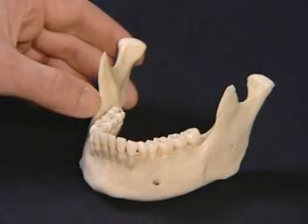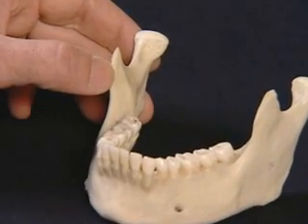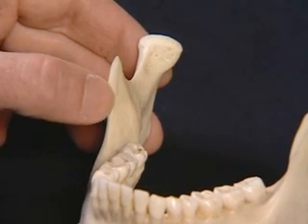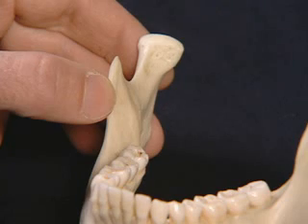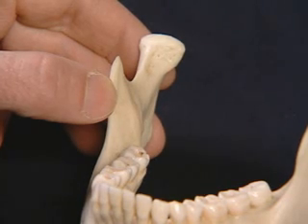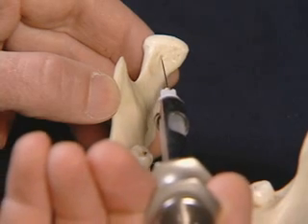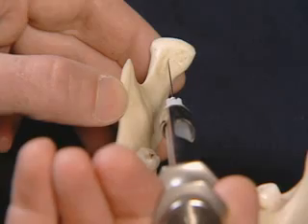You begin again by palpating the anterior border of the ramus. You then move superiorly to feel the coronoid process and the insertion of the tendons of temporalis. This will outline your lateral landmark for insertion of the needle. The needle will be advanced superiorly and laterally, advancing towards the neck of the condyle until you contact bone, withdraw slightly, aspirate, and inject.